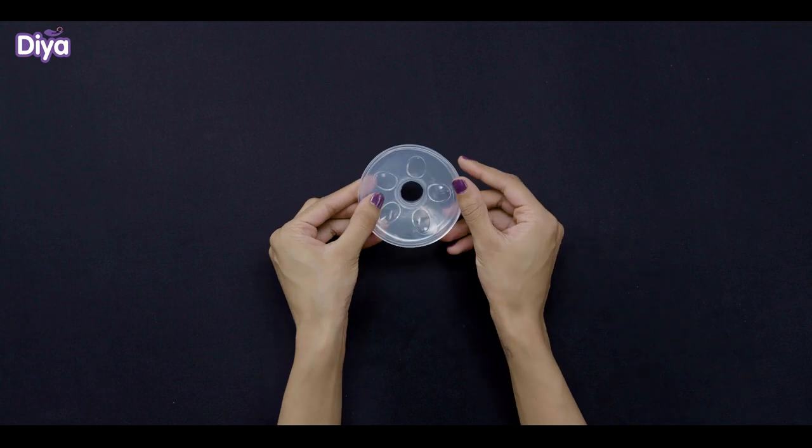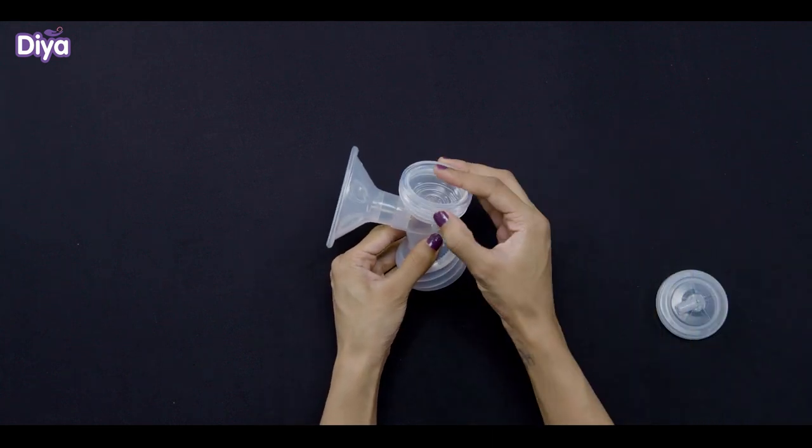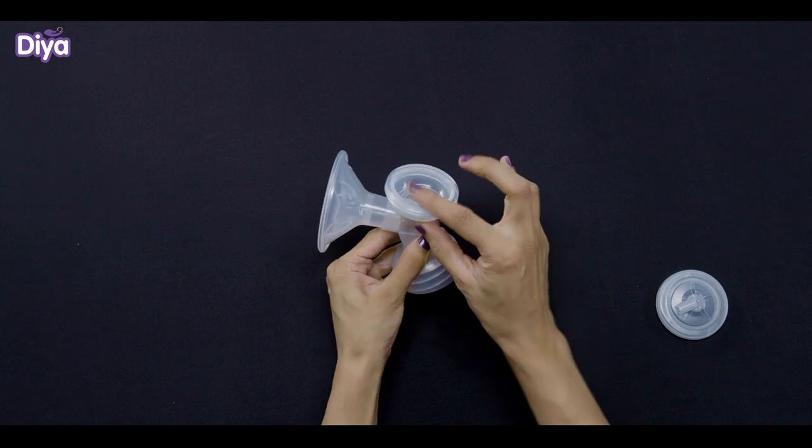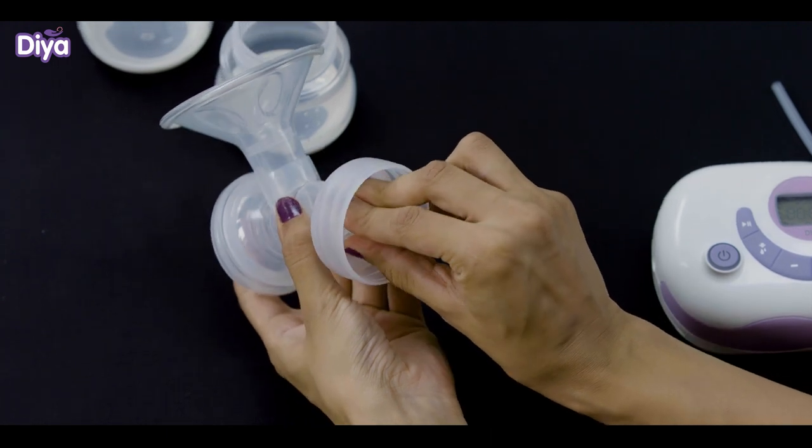Attach the silicon massage insert with the breast shield. Put the silicon diaphragm at the top of the connector and then put the cylinder cover on it. Tightly fasten the duckbill valve with both the connectors.